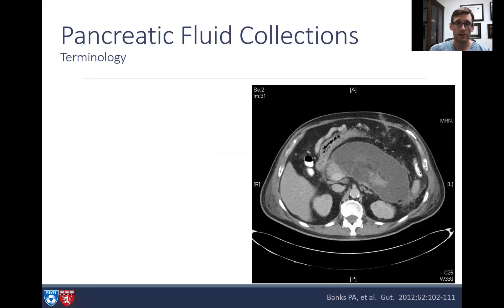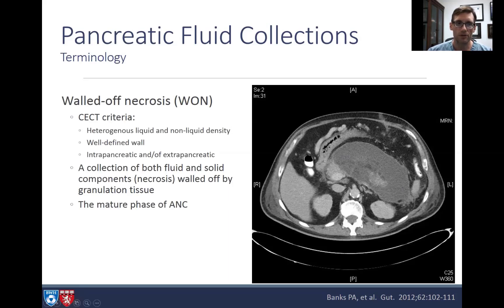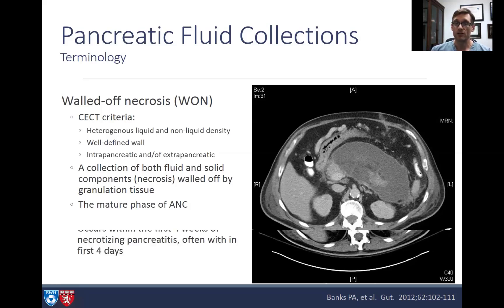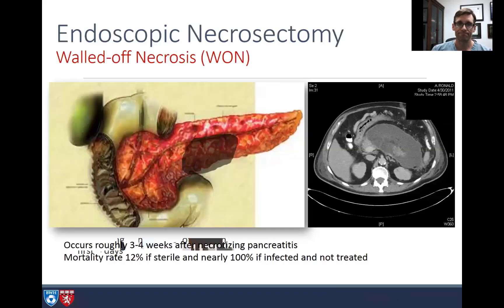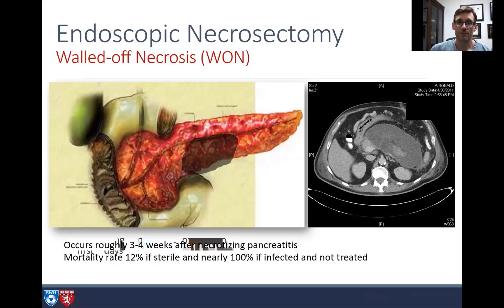Here is what we like to treat: walled-off necrosis. There's bright and dark pancreas, fluid, and a nice wall around the collection. CECT criteria show heterogeneous liquid and non-liquid densities with a well-defined wall, intrapancreatic and/or extrapancreatic components. This is the mature phase of an acute necrotic collection, typically occurring three to four weeks after necrotizing pancreatitis. Mortality is 12% if sterile and nearly 100% if infected and untreated.